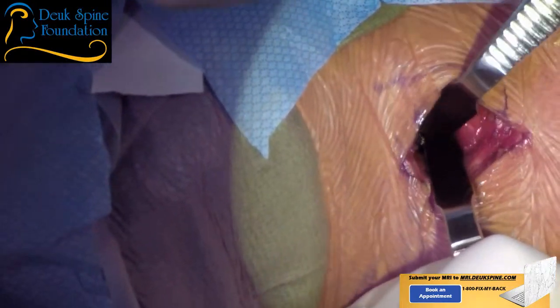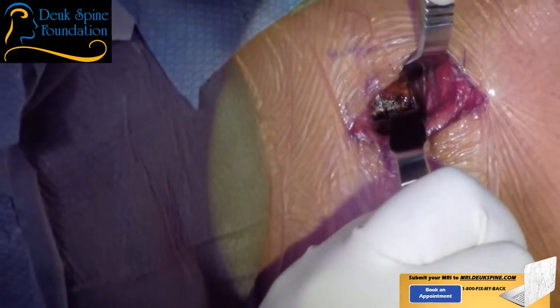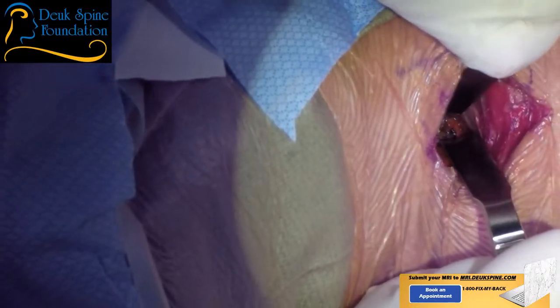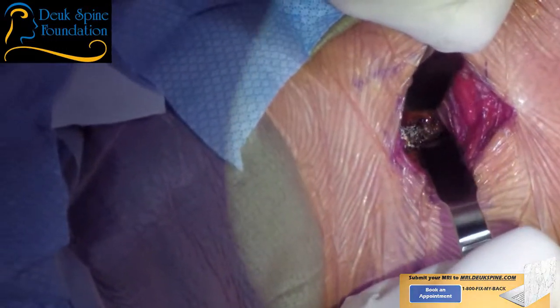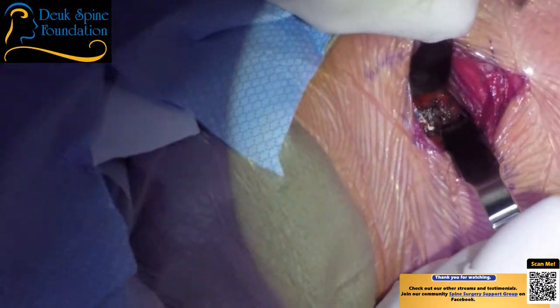All right, hold this here. How's our muscle relaxation? I think we're almost done needing it. But we just need it for a little bit more, like another 20, 30 minutes max.